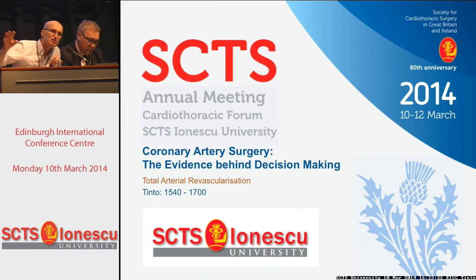What you find is that once you start using these systems, and for some reason you can't, the machine breaks down or whatever, you then actually feel slightly uncomfortable. Because when you have checked your grafts are patent, you know you can go home that night, you know you can open a nice bottle of wine, you know you can call your mistress, your wife, and you know you can have a relaxed evening. So it really does provide you with great reassurance, particularly when you're doing these slightly more complex reconstructions, to know that you've actually done what you think you have.